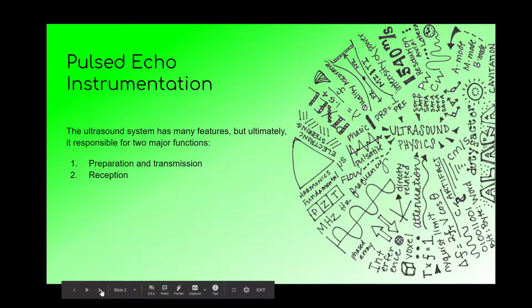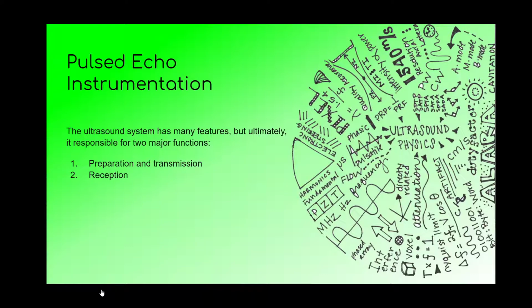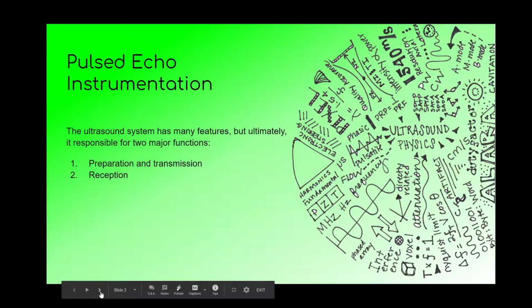So the pulsed echo instrument, or our ultrasound machine, really has tons of features, but it's ultimately responsible for two things. The first one is the preparation and transmission of an ultrasound beam, and then to get it back, the reception. That is all it needs to do. It needs to send a pulse out. It needs to get that pulse back and do something with it. So that is what a pulsed echo instrument needs to do.